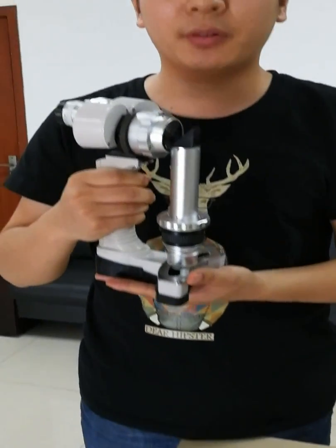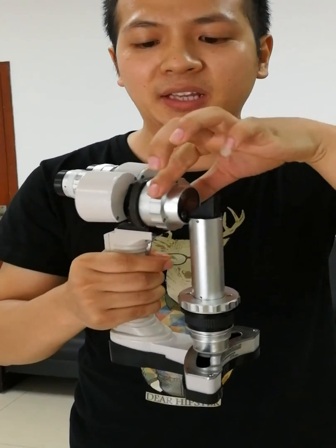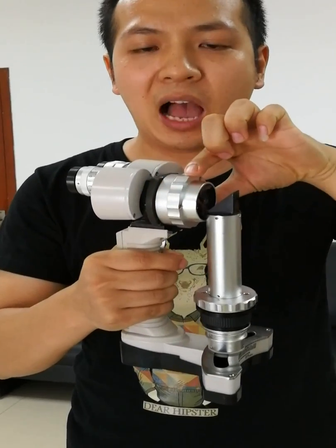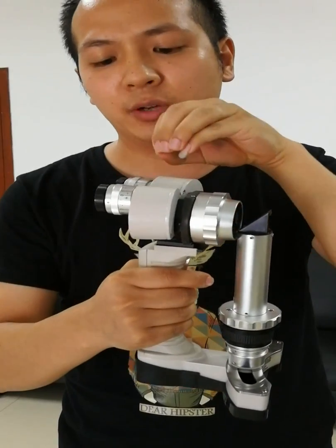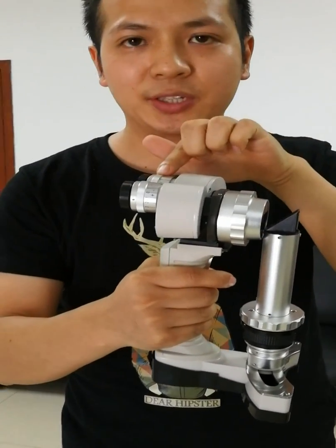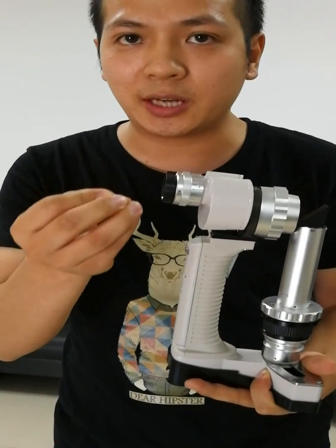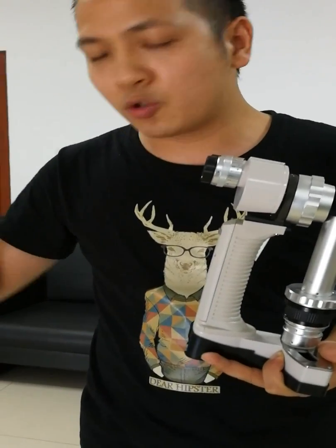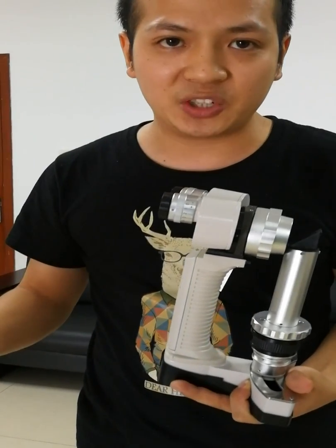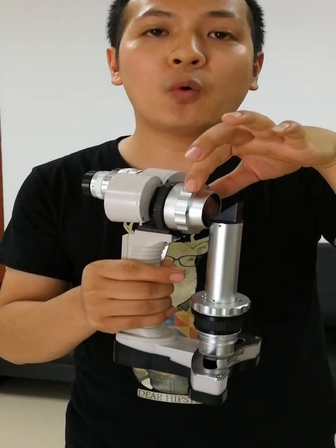Compared with other portable slit lamps, first, the magnification changes by rotating the optical parts. Other brands may require you to exchange the eyepiece, which is very small, and when putting it in the box it's easy to lose and also easy to drop on the ground and get damaged. With this product, you just rotate — you can avoid all these problems.